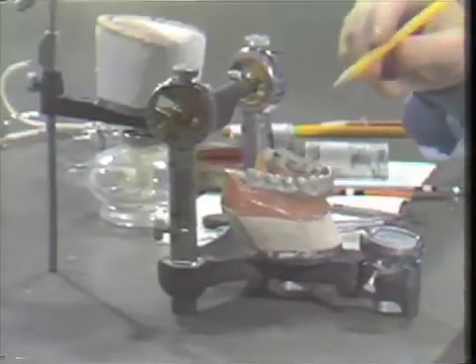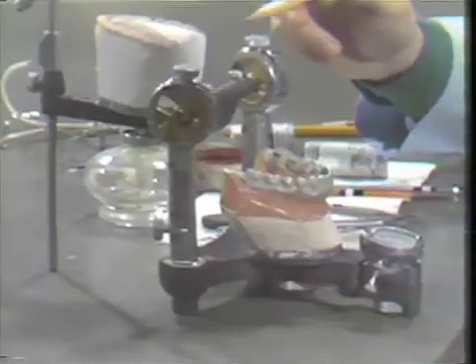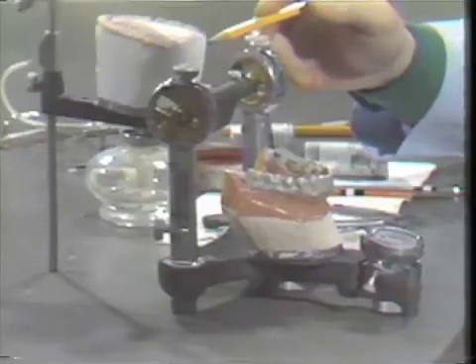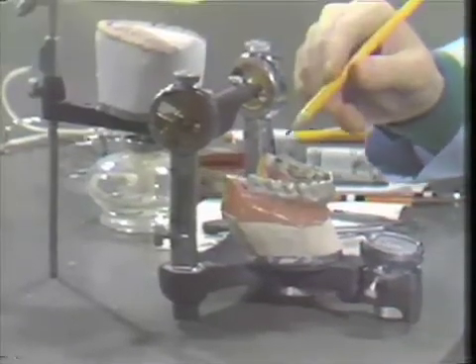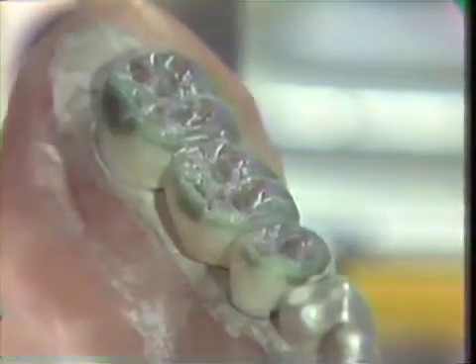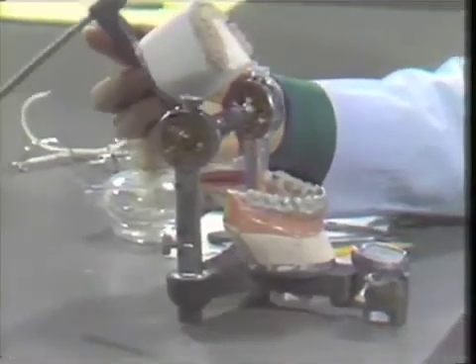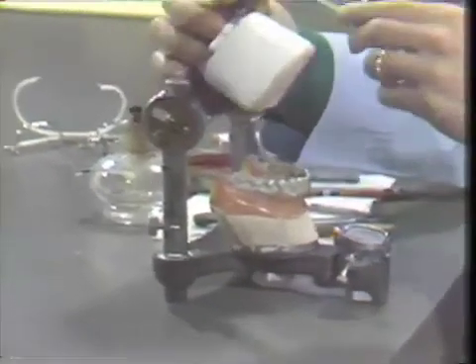Now returning to our models, we have placed our functionally generated stone record in the maxillary part of the articulator. We've also dusted our wax-up with zinc stearate. We'll now close the articulator to verify whether or not any of these interferences, which we have just graphically depicted, are present in our wax-up.